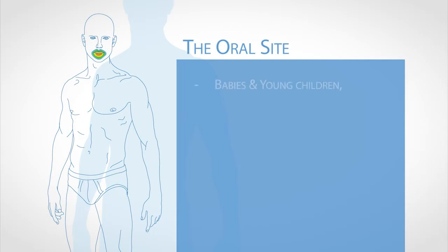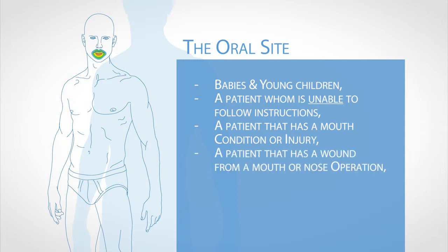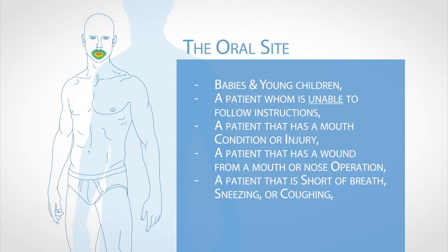A temperature should not be assessed at the particular site under the following conditions: the oral site, babies and young children, a patient who is unable to follow instructions, a patient that has a mouth condition or injury, a patient that has a wound from a mouth or nose operation, a patient that is short of breath, sneezing or coughing, and a patient that smoked, ate or drank within 15 to 30 minutes.